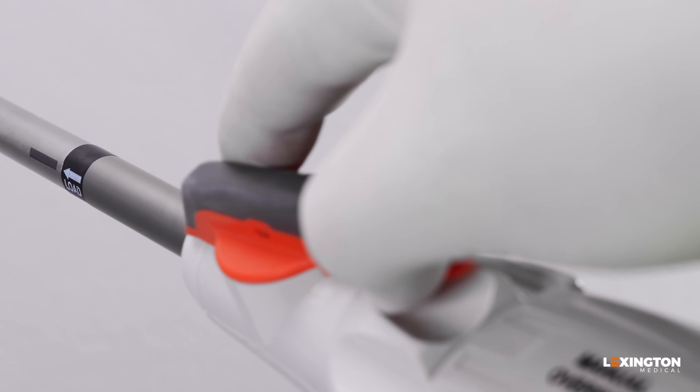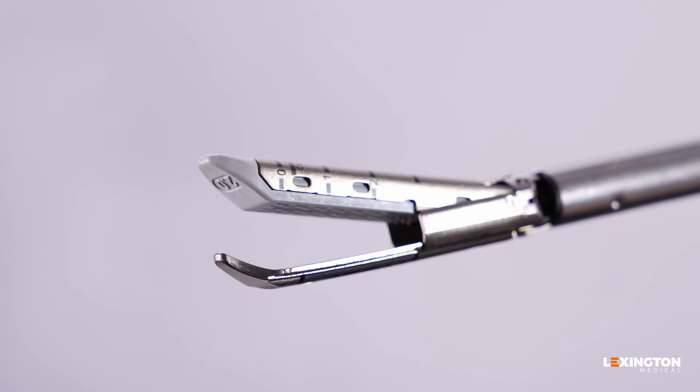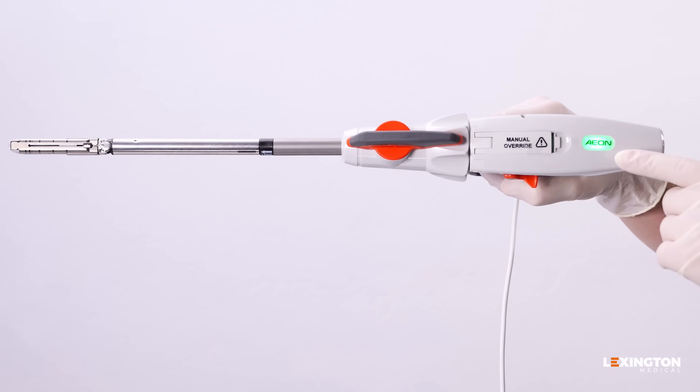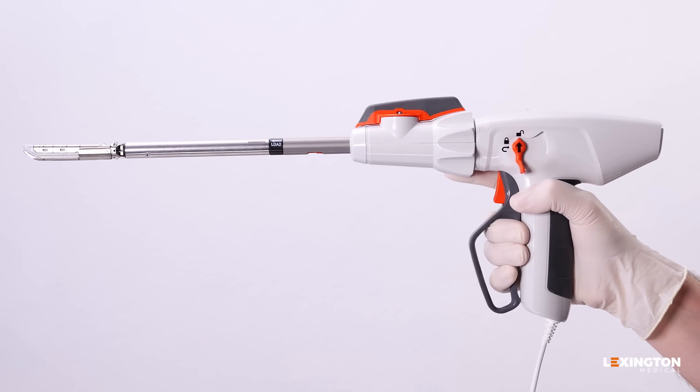With smooth, precise articulation, Aeon empowers surgeons to get the exact angle they need, even in the tightest spaces. Featuring intuitive, user-friendly controls, Aeon simplifies the surgical stapling process.